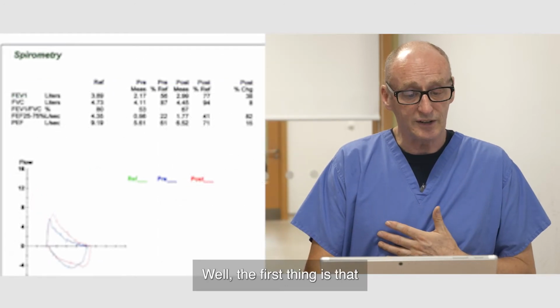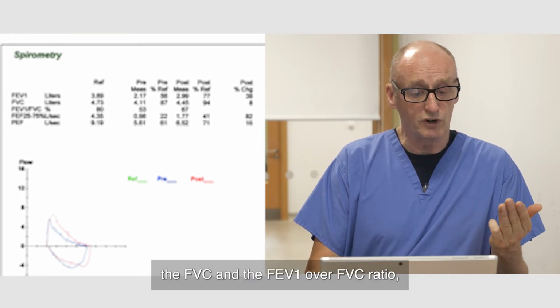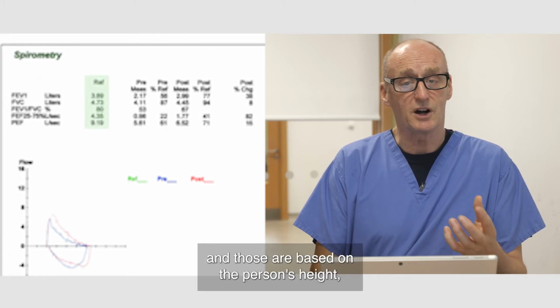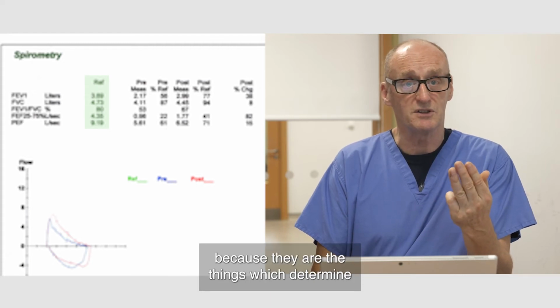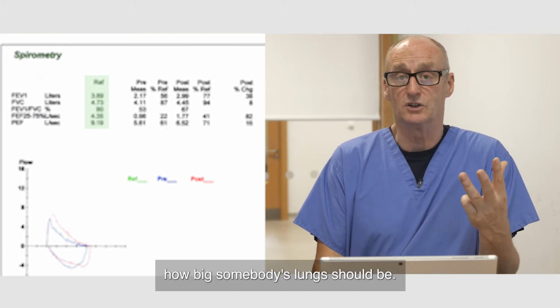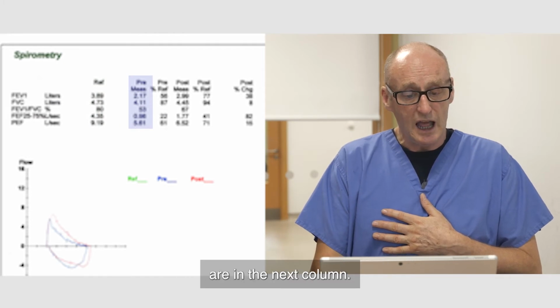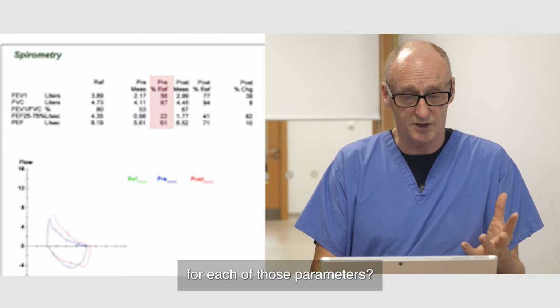Well, the first thing is that those parameters we've been talking about, the FEV1, the FVC, and the FEV1 over FVC ratio, there are predicted values for those printed out usually in the left-hand column, and those are based on the person's height, age, weight, and sex, because they are the things which determine different size and shape of your lungs and basically allow you to predict how big somebody's lungs should be. So that's what's in the left-hand column. Then the measures that are actually obtained during the test are in the next column.